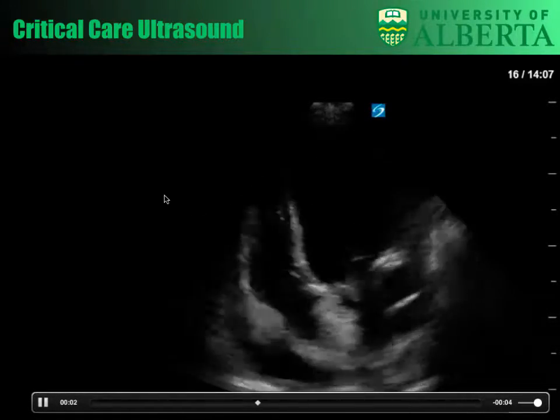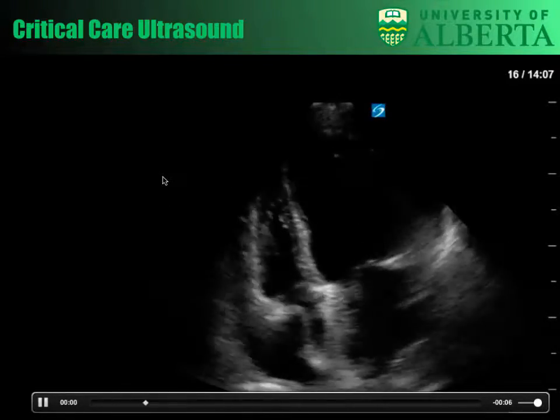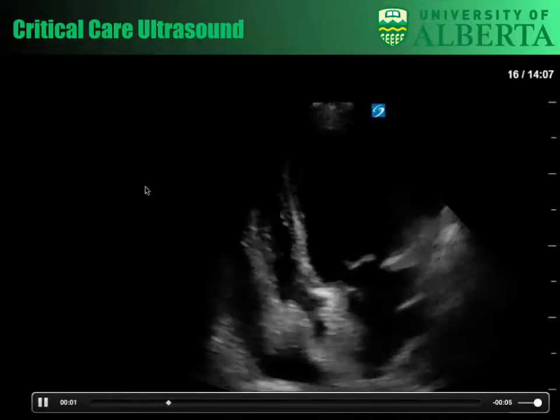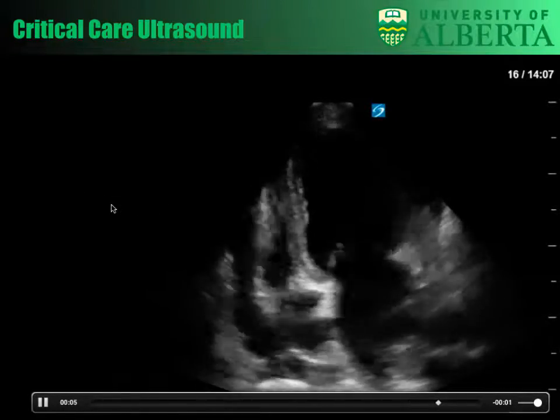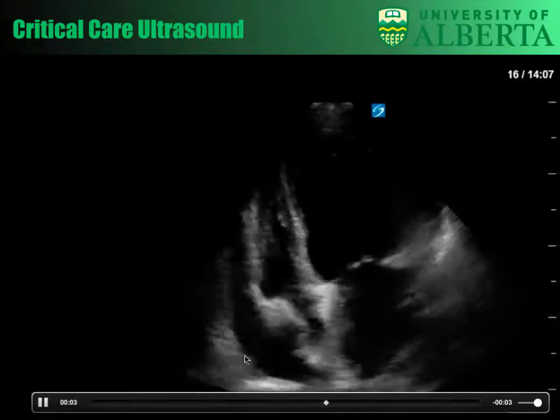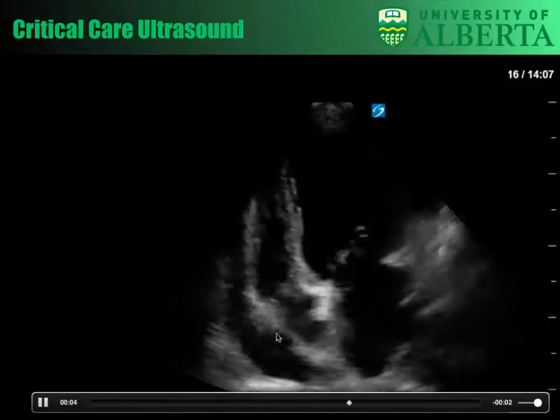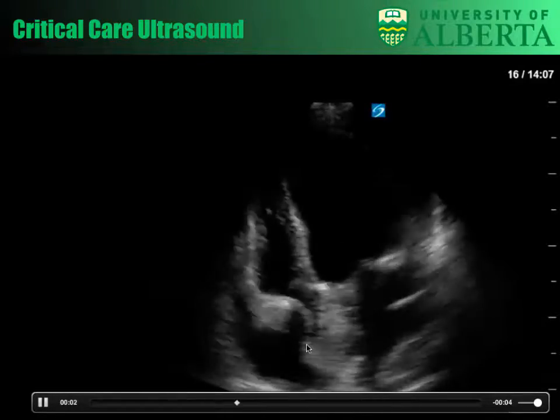Yeah. And of course, as we can see, the left ventricle is fairly squeezing. Yeah, exactly. We determined from other views that the LV function is probably depressed, I think that's important to take home. And again, we see that nice anechoic space, where we think there's at least some compression of the right atrium.